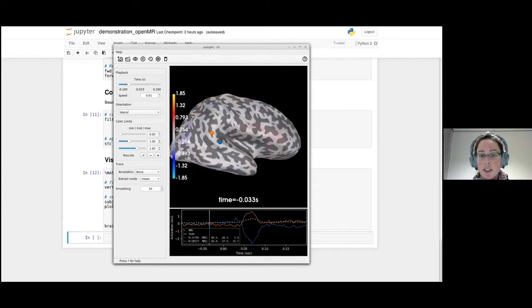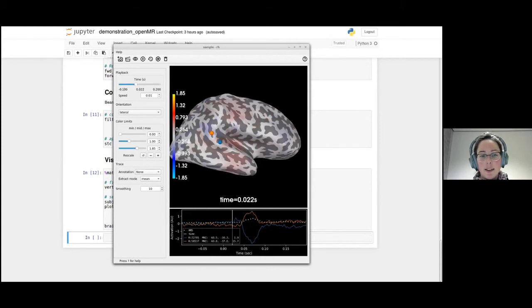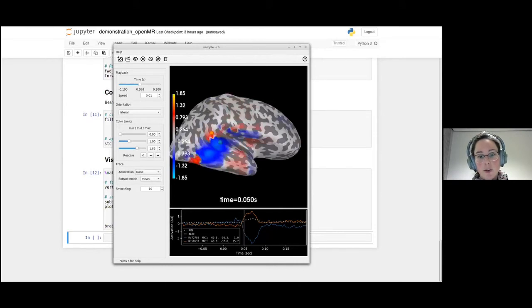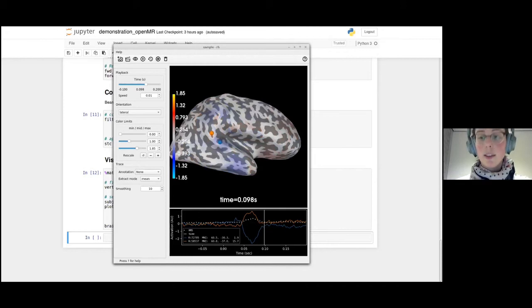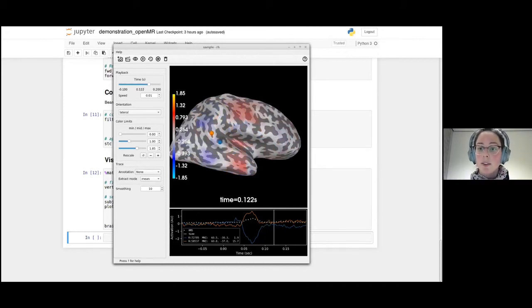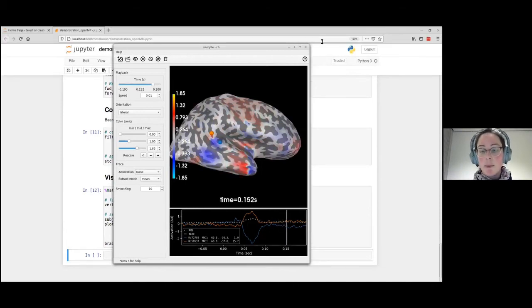Or we can just sit back, relax, and see this activity unfold in front of us as a movie. So far, not much is happening, which makes sense because the stimulus is not even presented. Now we present the stimulus and we can already see the first activity coming in. These movies are also saveable to disk — you could use them as a supplement for a paper publication.